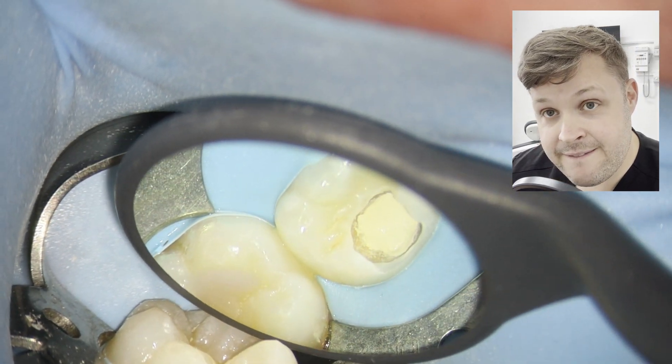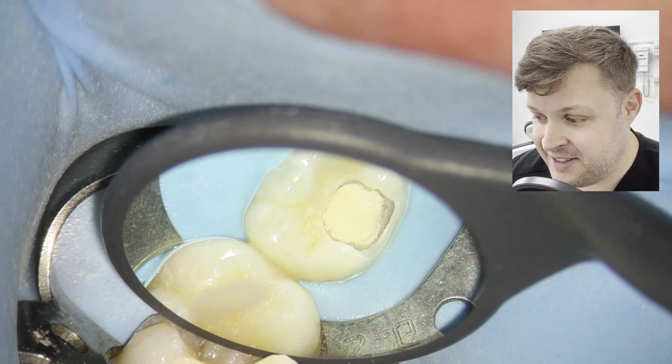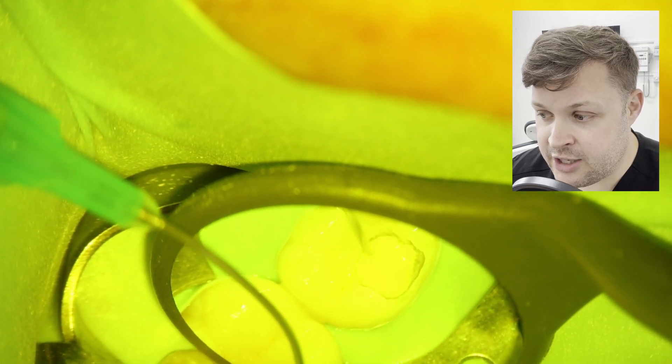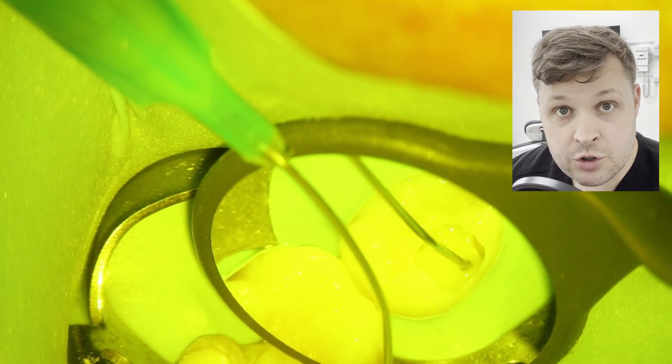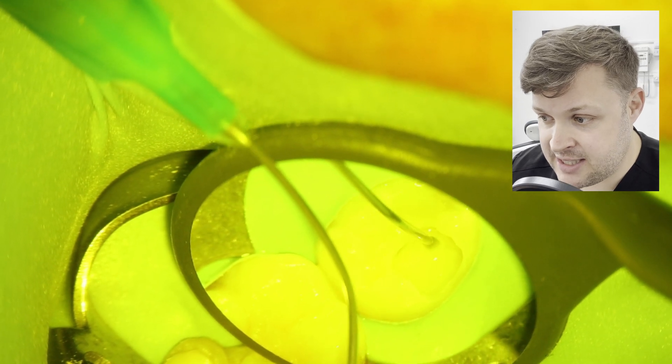After 15 minutes I check the cavity and give it a very gentle prod just to confirm it's nicely set. Then I'm ready to place a GIC over the top. I'm using Vitrebond, a glass ionomer cement, placing the GIC layer over the bioceramic.